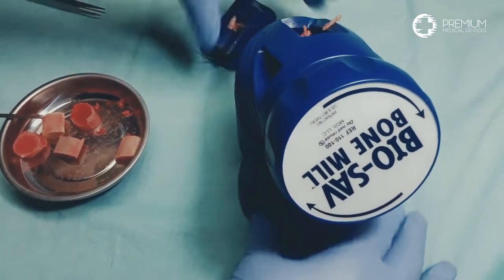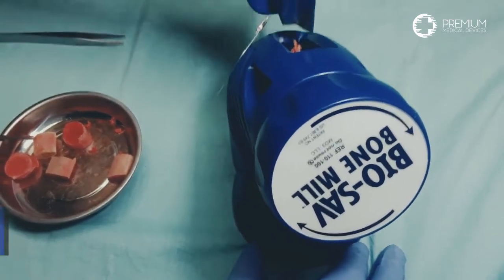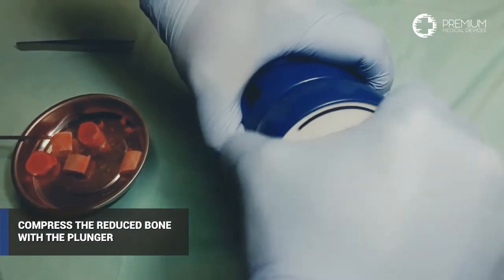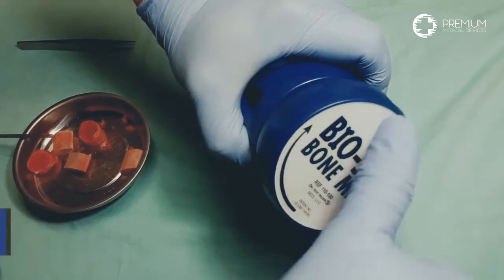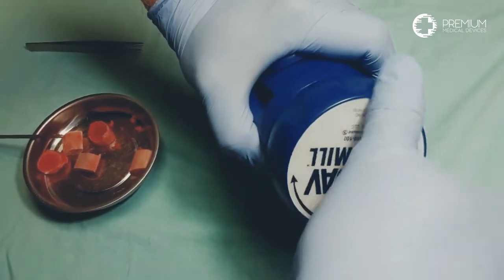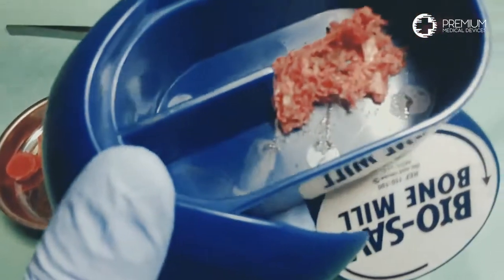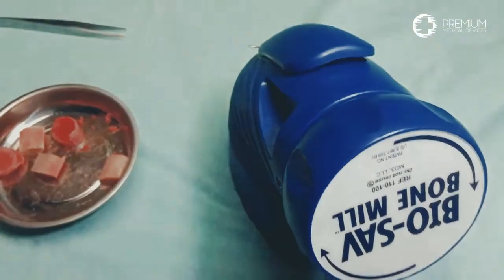The bone mill will size bone to the surgeon's preference — a very unique selling feature. Transferring the bone from the tray back to the chamber allows for further size reduction. Once all the bone is back in the chamber, the operator aggressively pushes down on the plunger to compress the bone into the bone mill chamber. This compression process allows the cutters to shear through the larger bone fragments, reducing it again by almost half. Once the knob has no resistance, the milling process is complete.